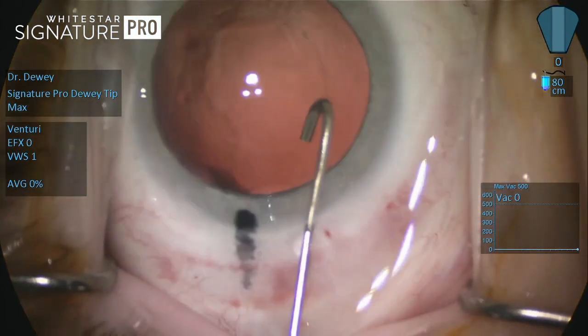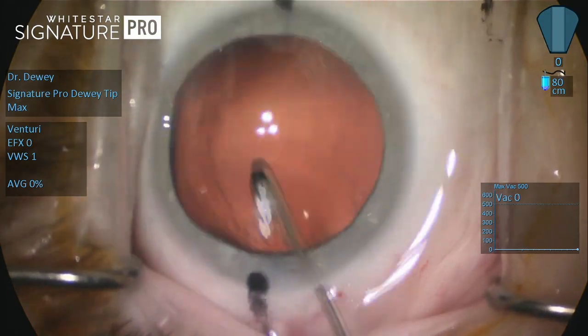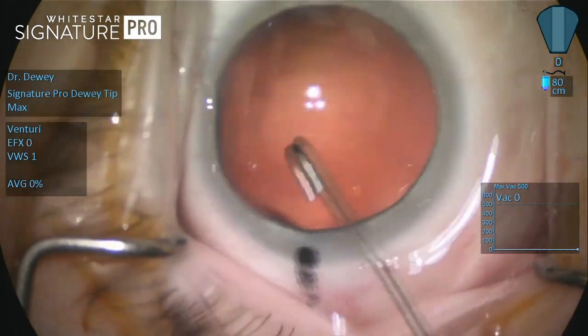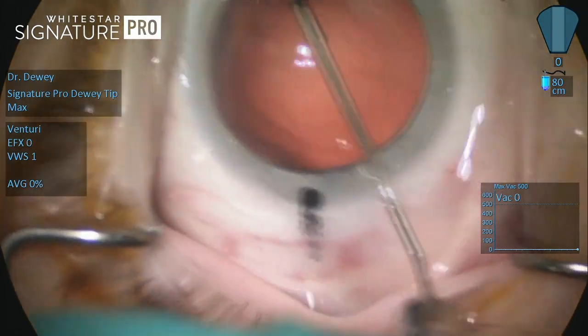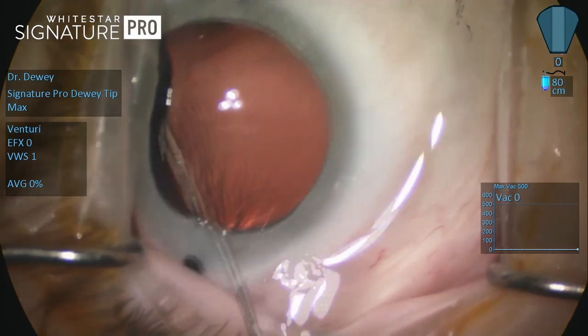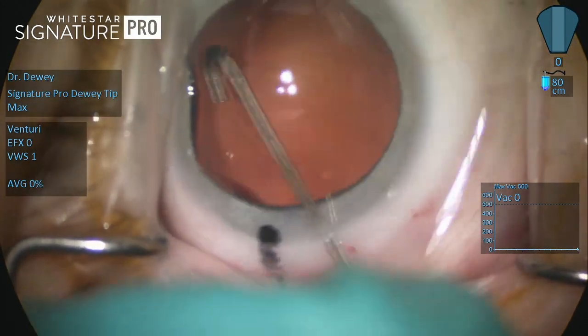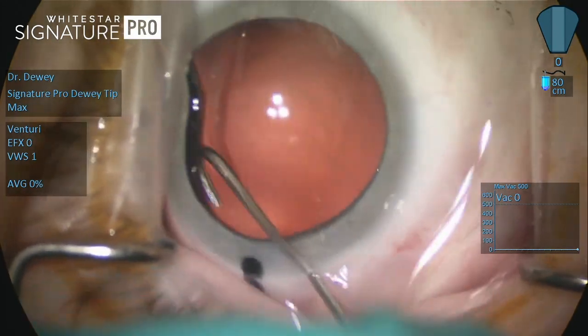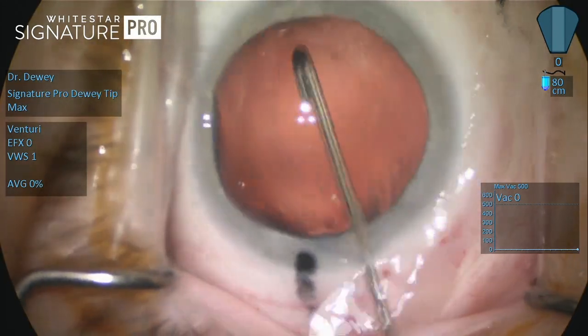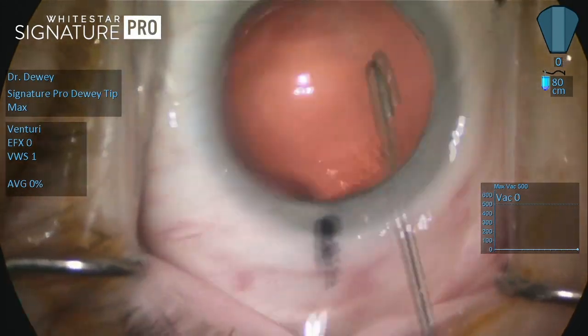Like anything we adopt in our surgical armory, practice is what it takes to make it seem natural. With the White Star Signature Pro system in venturi vacuum on femtosecond cases, it seems very natural at this point.